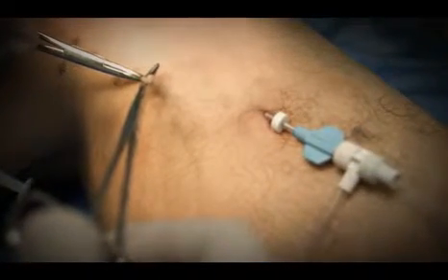The combination of sealing the abnormal refluxing vein with a laser or radiofrequency catheter, along with performing phlebectomy of the bigger veins, will usually be a thorough treatment of the problem with varicose veins and venous insufficiency.